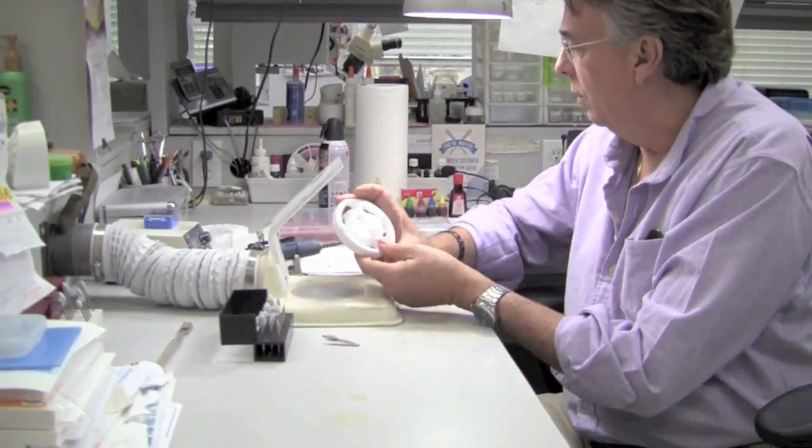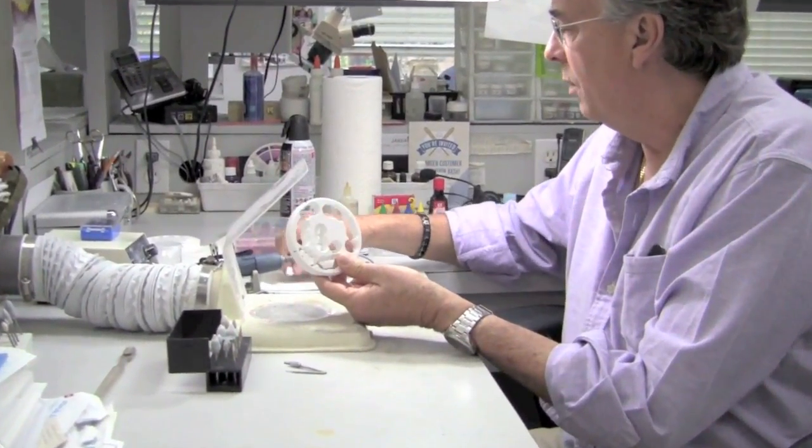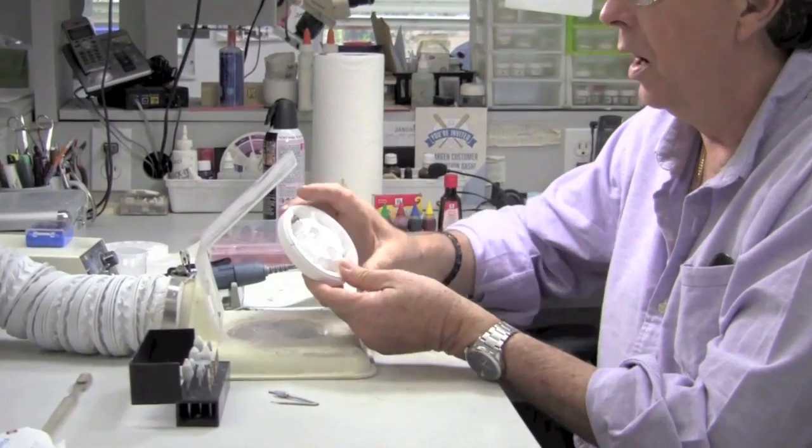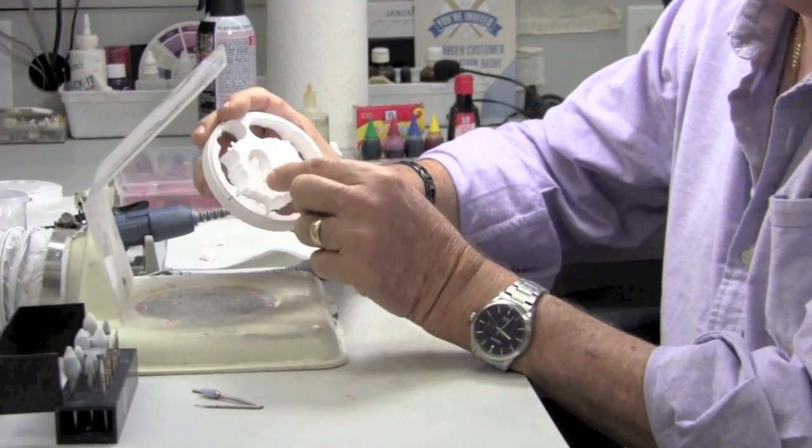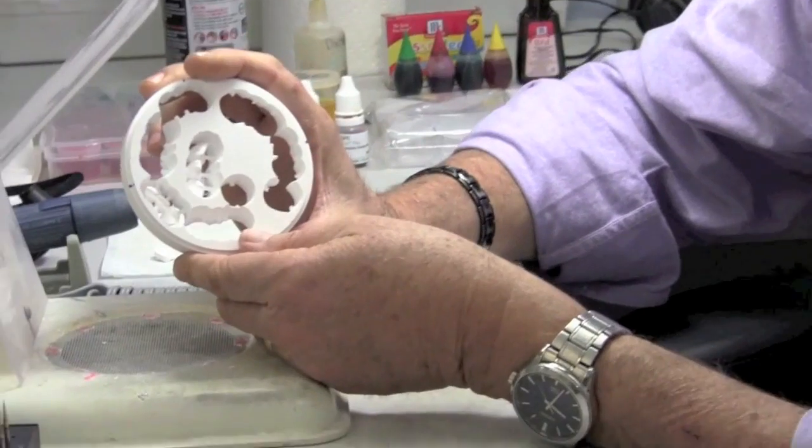So that being said, we also sprue our units with only two sprues, one buccal, one lingual. There's only bridges in here, but I have singles that I just took out of this puck. And we'll typically ask the mill to remove the sprues on the facial or buccal surfaces.